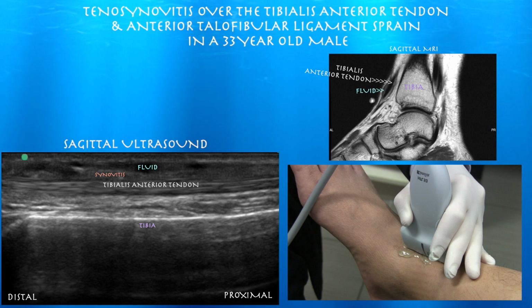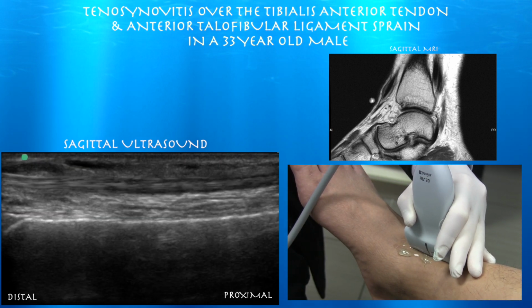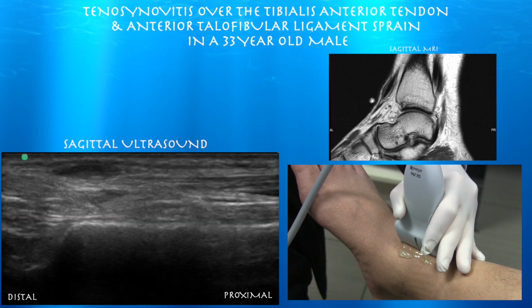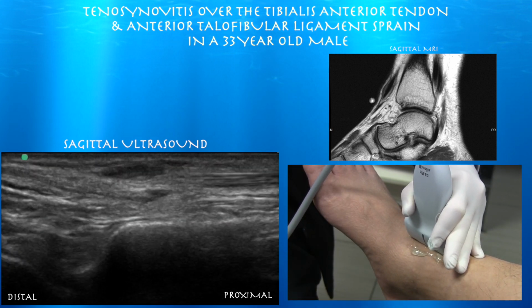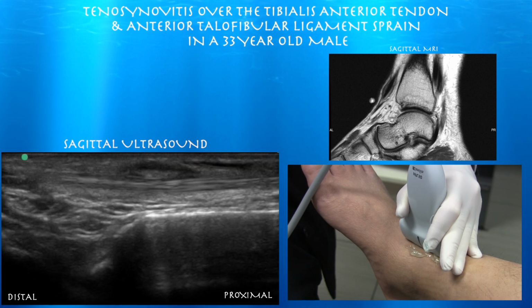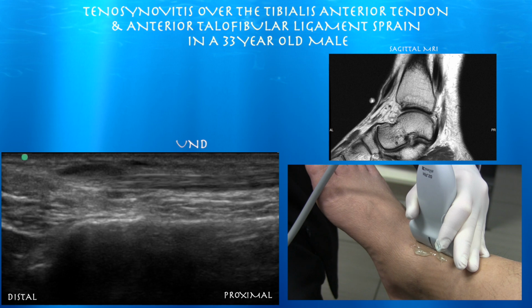Again, upon review, this is probably more consistent with tenosynovitis versus a true ganglion. But while I was examining it, since it had that feel of a ganglion, I decided to call it that. And you can see some fluid collections above it. Perhaps it felt like a ganglion because of the significant amount of inflamed synovium around the tendon, which can give a nodular type of feel to the tendon.